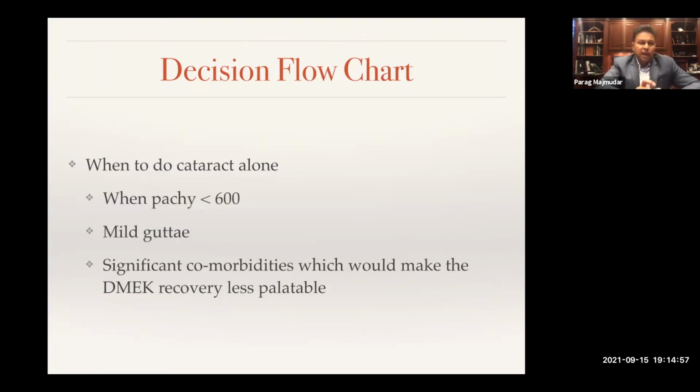If you think that the cataract is a little bit more prominent, at least in terms of the percentage of involvement in their vision, then I think you can definitely decide to do the cataract alone and see whether or not, if you do careful cataract surgery and monitor your phaco energy and make sure you're not phacoing in the anterior chamber, you can probably get away with cataract surgery alone and allow the patient to make a little quicker recovery and get back to normal activities where they may not need the DMEK.